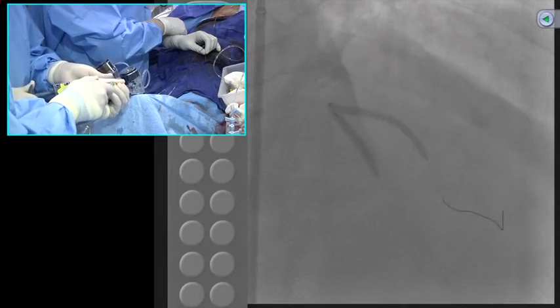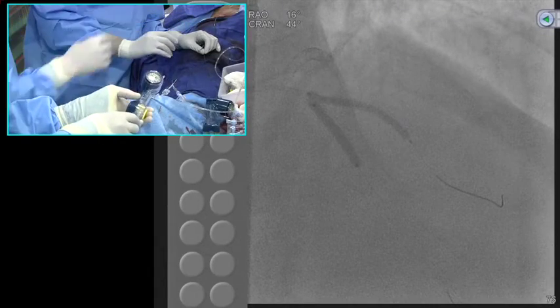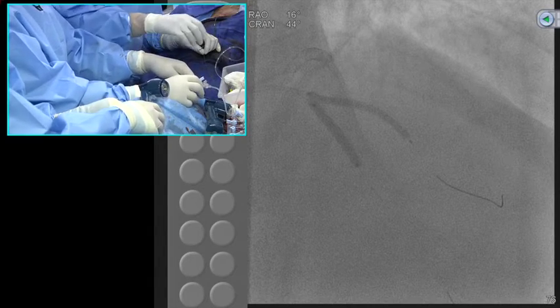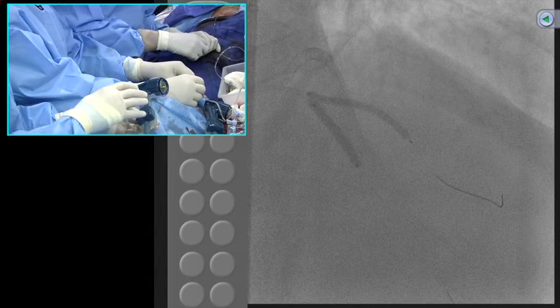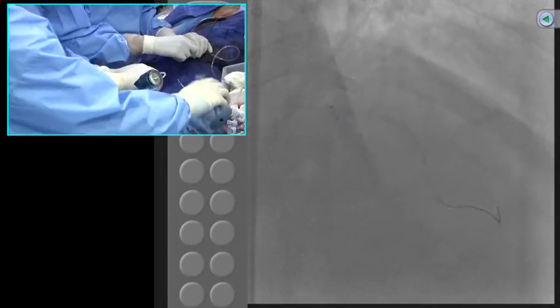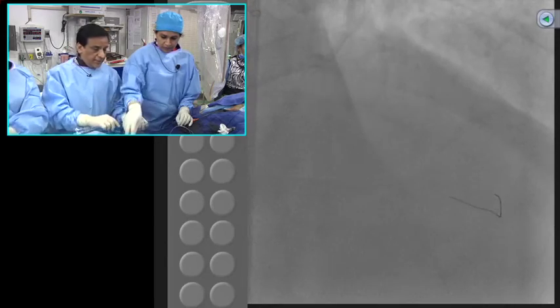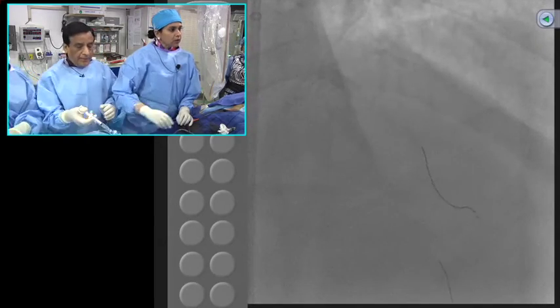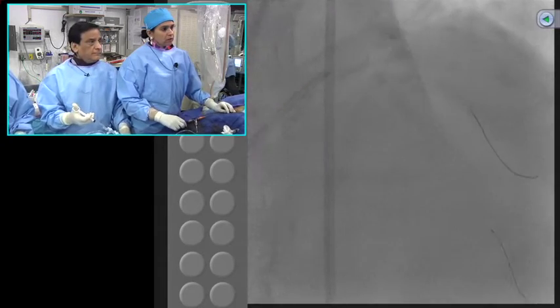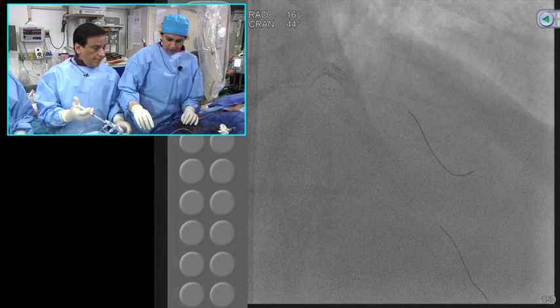Very nice expansion. The distal part of the diagonal stent previously was not expanded. Yes, now it looks good. So how many atmospheres was the last simultaneous? The simultaneous was 12. Okay, 12. And individually we went up to 16 atmospheres, and actually 16 is the one which expanded the diagonal. Okay, 16, ready? You are looking at a 2.5 there. I know.